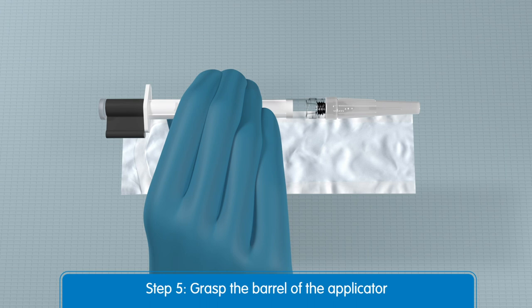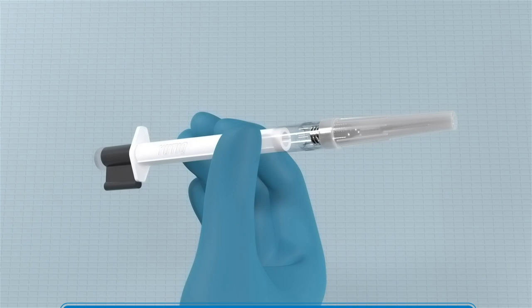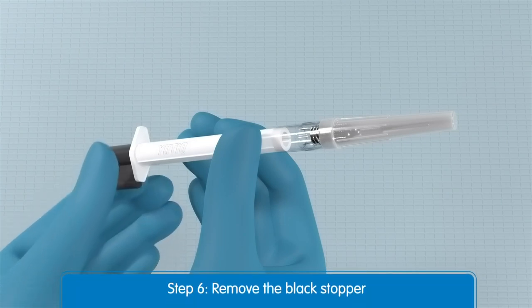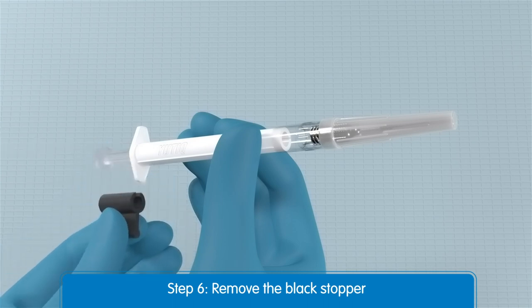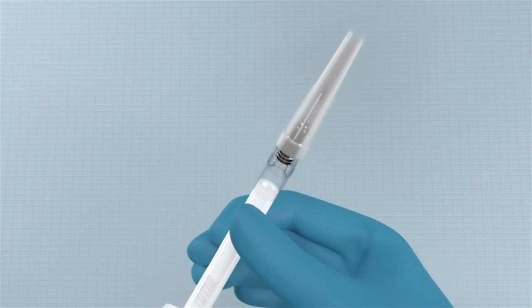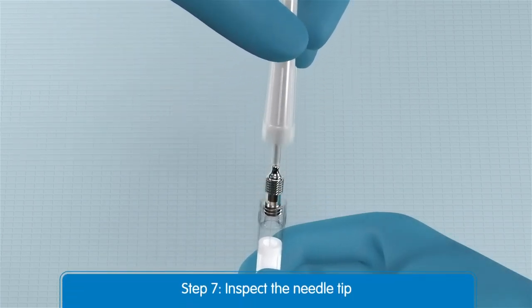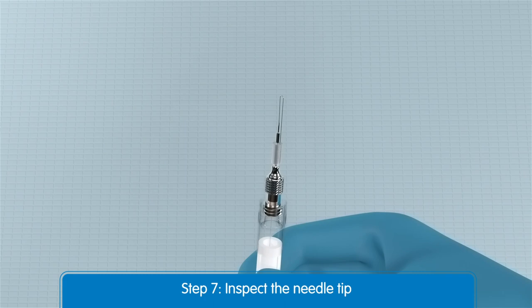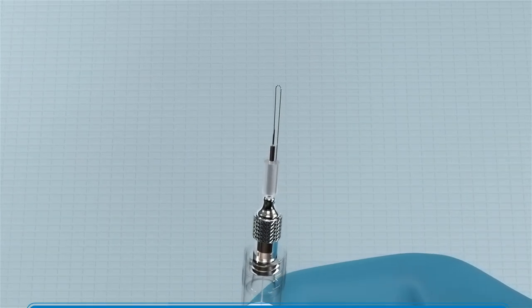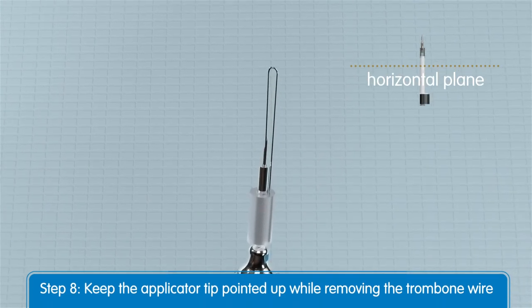It is important not to grasp the plunger to ensure the Utique implant does not fall out. Remove the black plunger stop from the plunger. Carefully remove the protective cap from the needle and inspect the needle tip to ensure it is not bent. From this point and just prior to injection, keep the applicator tip above the horizontal plane to ensure the Utique implant does not fall out.